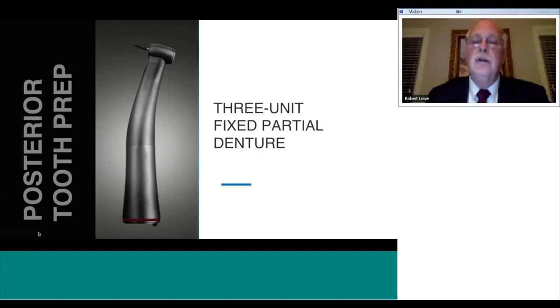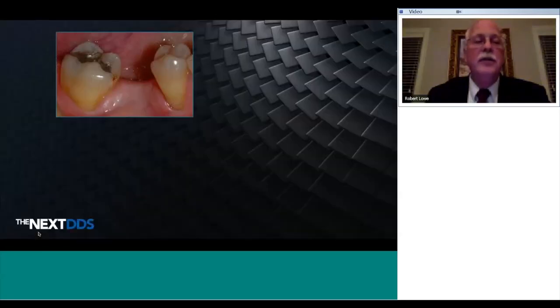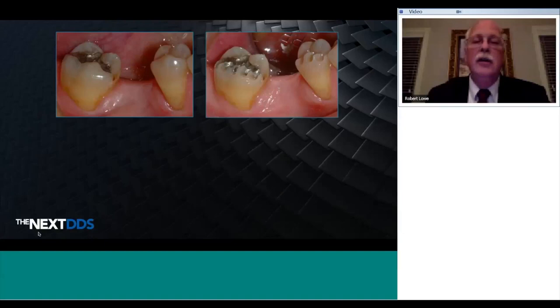Let's look at a fixed partial in the posterior. Here's a typical situation where we have a first molar that's been lost, and we've got slight angulation of the preparations, which needs to be accounted for when you prepare to get line of draw. Now, I follow the same rules when I prepare posterior teeth. Even more importantly, depth cuts up to 2 millimeters to create clearance.